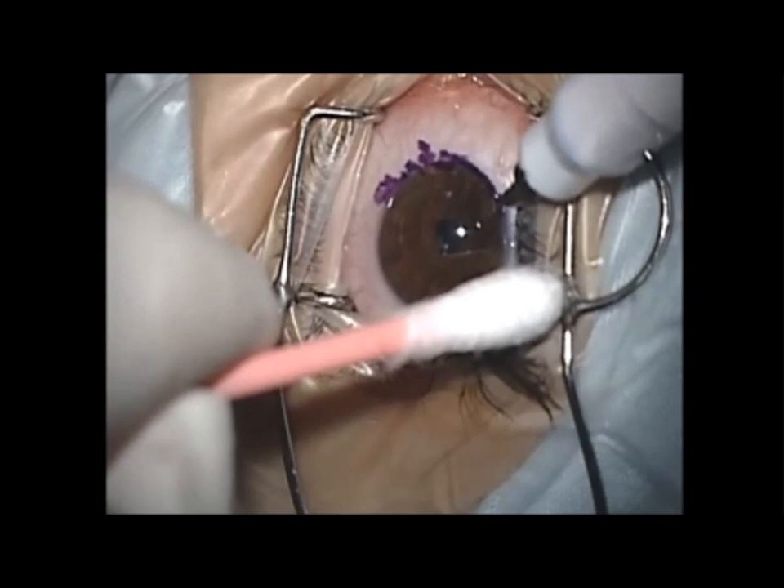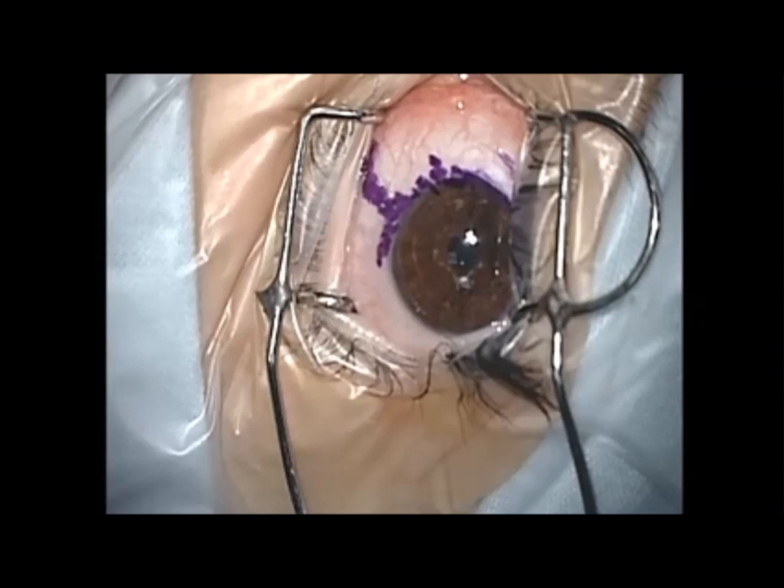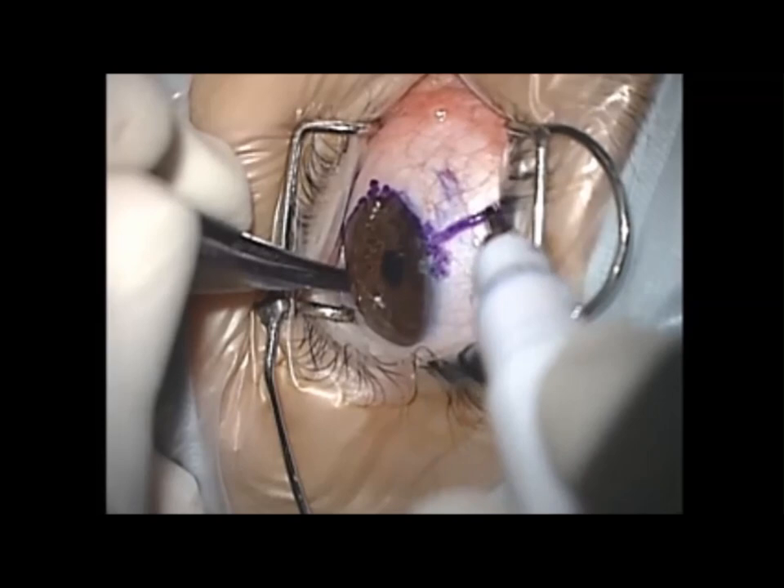In some cases, you may want to add a mark on the conjunctiva along your incision lines to allow easier identification of the cut ends of the conjunctiva. This is particularly important in complicated and recurrent cases where identification of the conjunctiva at the end of surgery might not be easy.